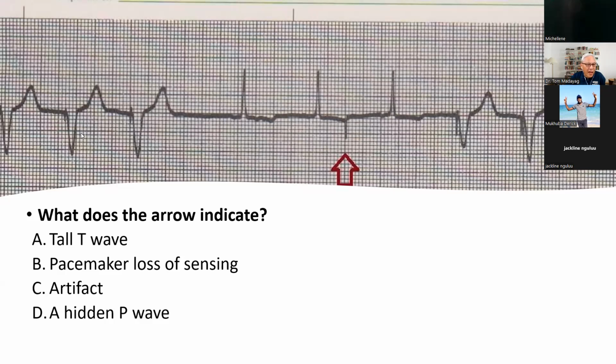So having said that, there are several problems that you might encounter whenever you have a pacemaker.